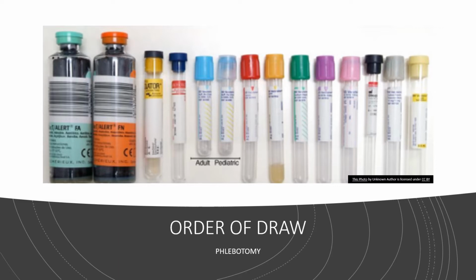I just try to limit these tubes, and the flower picture and what we go through on the slide is going to be limited to the tubes that you are most often going to use as a phlebotomist, in the order in which they are drawn. But remember, the most important part of this for you is that we want to draw these in the proper order to avoid cross-contamination of one additive going into another tube, which could possibly lead to invalid test results, which could lead to misdiagnosis, which then could lead to incorrect treatment.